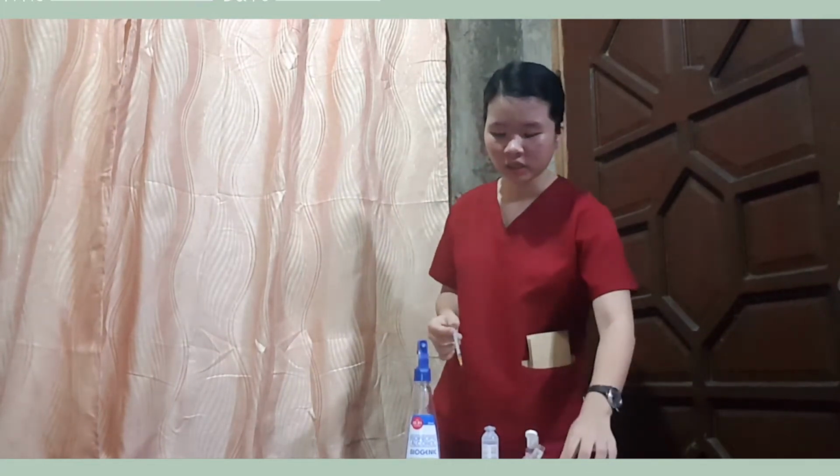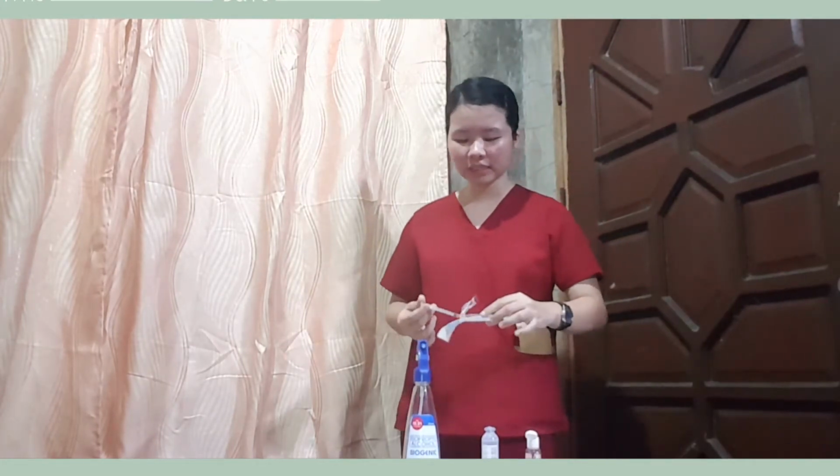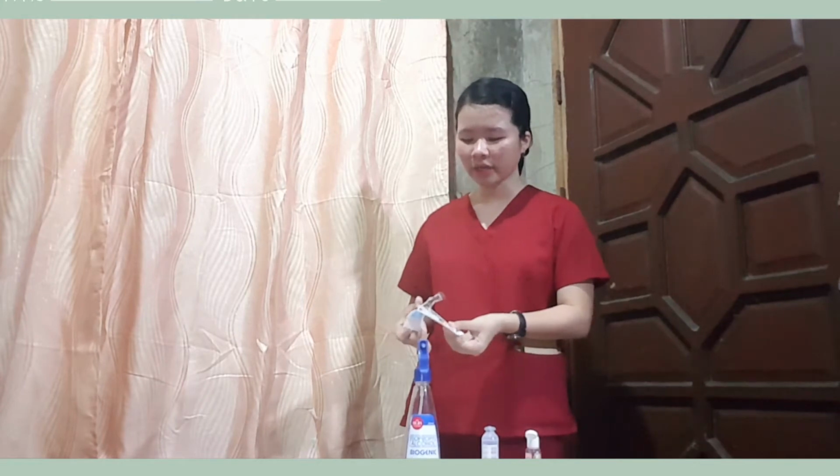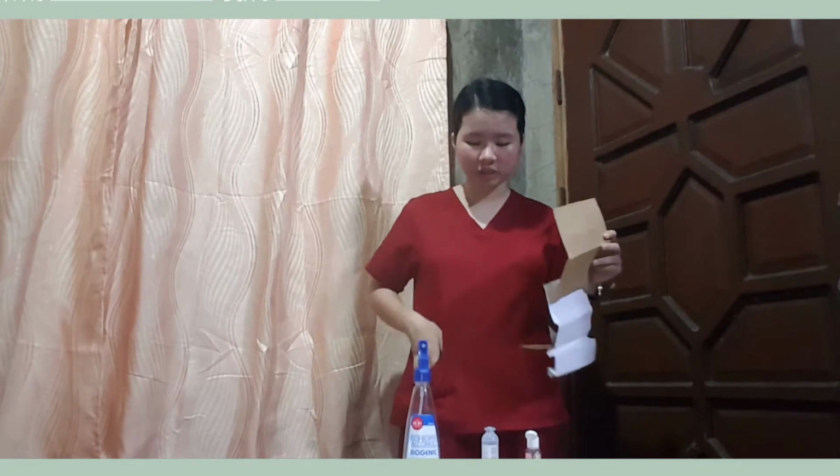So now we're going to proceed to procedure number 11, which is do the second checking of the medication. But before that, we're going to set this aside first on a safety and sterile container. By doing this, you ensure that the right patient receives the right medication.